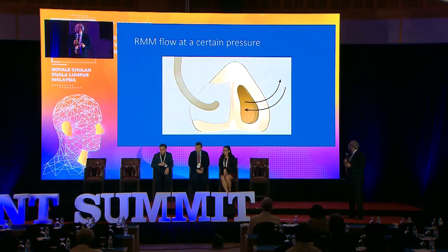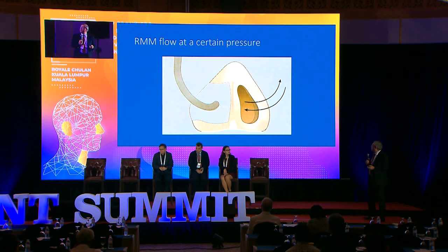I will talk about nasal measurements. The enemy of nasal examination is the nasal speculum. You should examine the nose without a nasal speculum because you cannot evaluate the nasal valve. I have been doing these nasal measurements for a long time, and I can tell you about 5 types of measurements. The last one is experimental, and I have all these machines in my department.